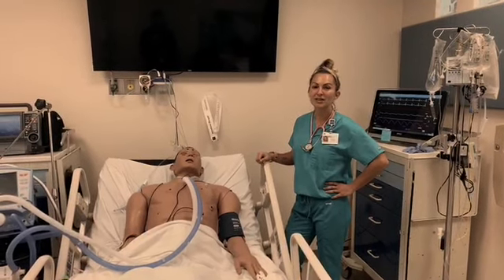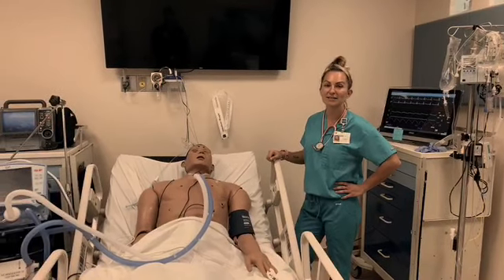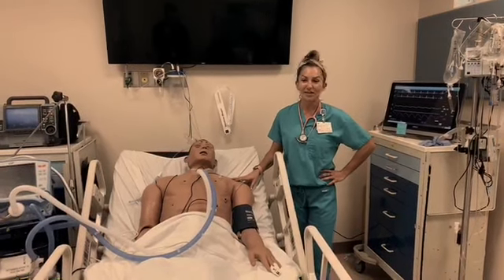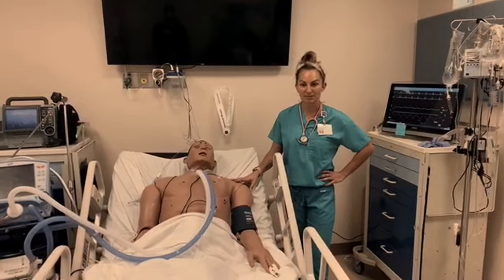We're here today to talk a little bit about early and late complications status post tracheostomy placement. We're going to start today here in the simulation lab. Our patient's name is Mr. John Doe. He has just returned from the OR, status post tracheostomy placement.